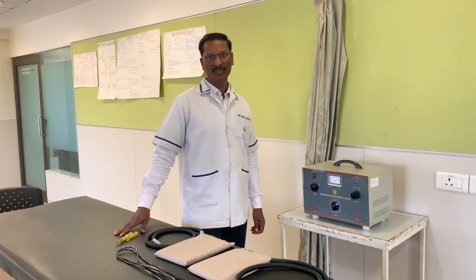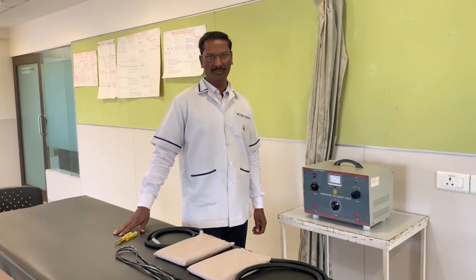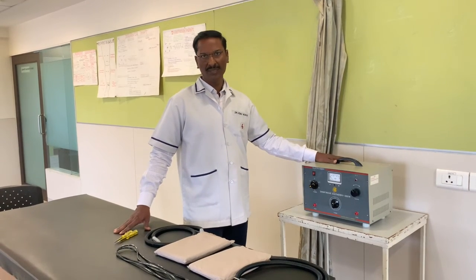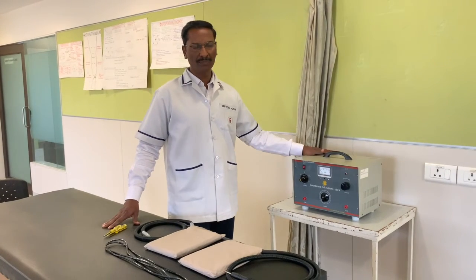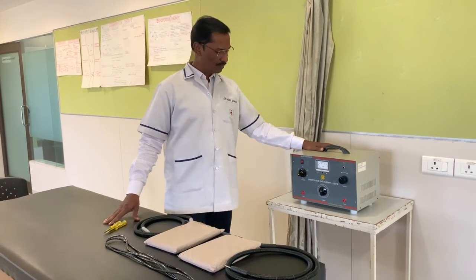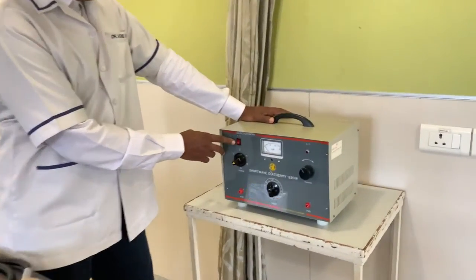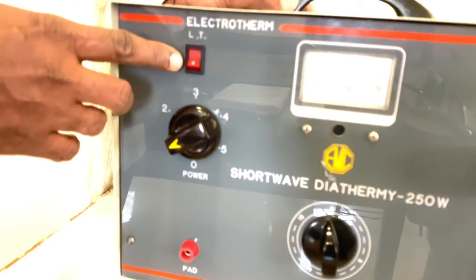We'll continue with the practical demonstration of testing the apparatus, short-wave diathermy. First, I would introduce you to the parts of the short-wave diathermy. Here we have this short-wave diathermy machine, which is a mini one in nature. It is of 250 watts. The first thing is we have a switch, which is a rocker type of on-off switch with LED indicator.